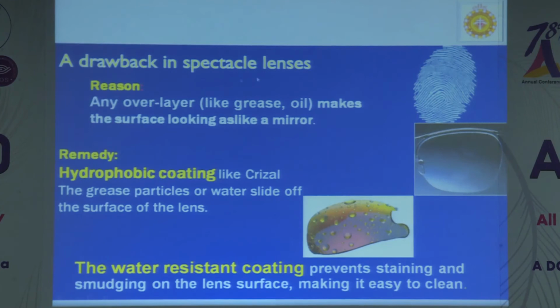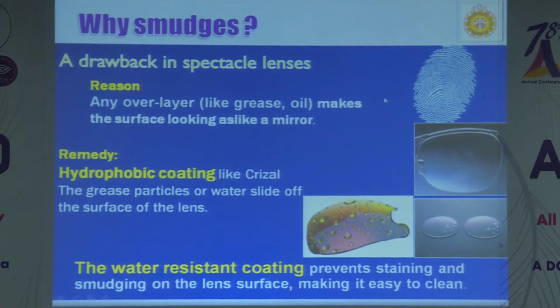So one of the drawbacks with the spectacle is smudge or oil. Your fingerprint will show on the spectacle and everything. So you can have a hydrophobic coating or water resistant coating. Just by shaking the lens, all the water molecules, all these things will disappear. So that coating is also available.